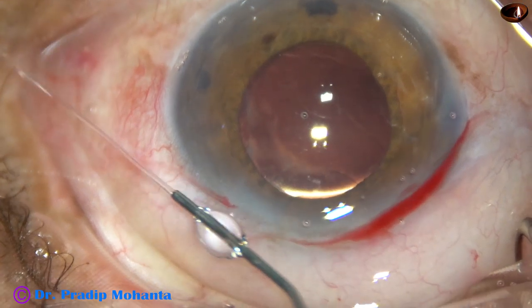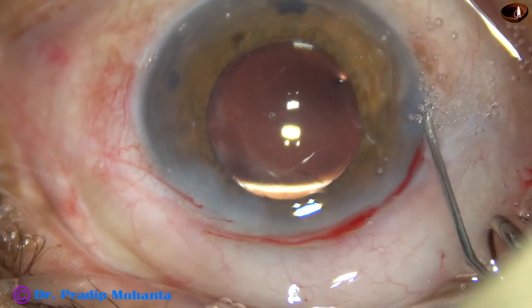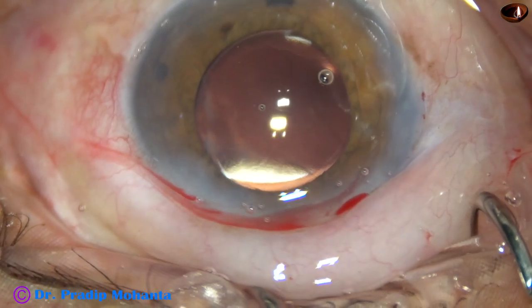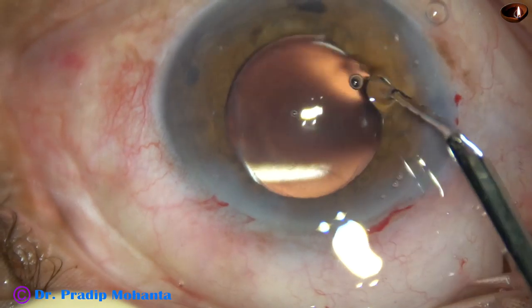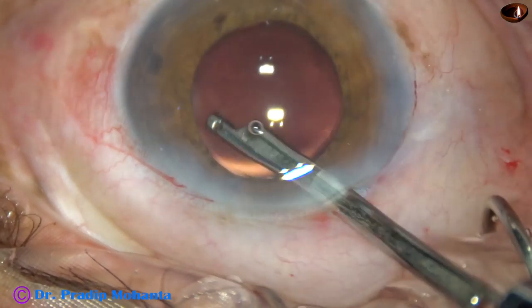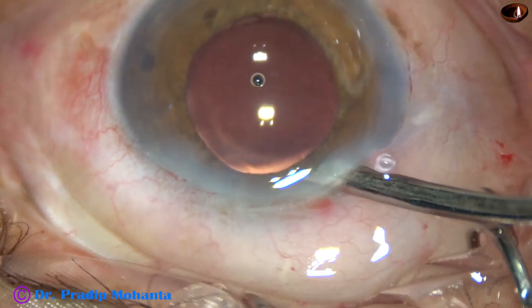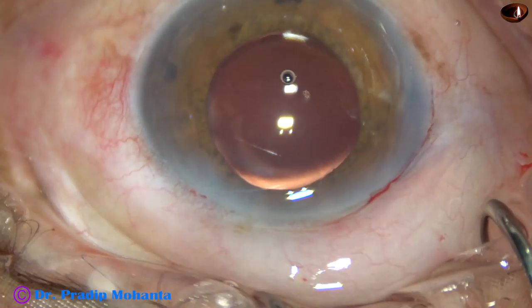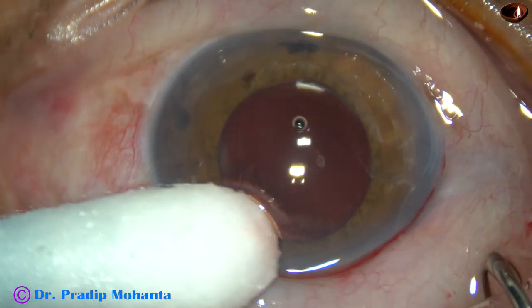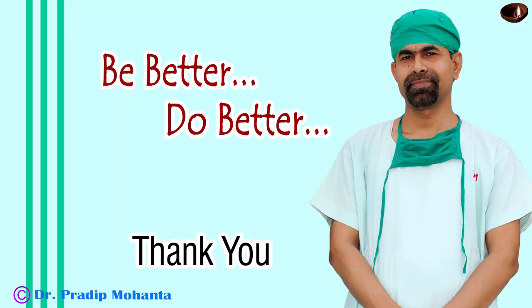Now the side ports are closed by corneal stromal hydration. The corneal stroma becomes thick and the side ports close. This is the final lavage of the anterior chamber. Some visco that was sticking to the posterior aspect of the cornea — that is on the corneal endothelium — comes out at this time. So we can see that the anterior chamber is totally free of viscoelastic substance. Now the integrity of the wounds is checked — there should not be any leakage from any side. Then some antibiotic eye drops are applied and the case is concluded.